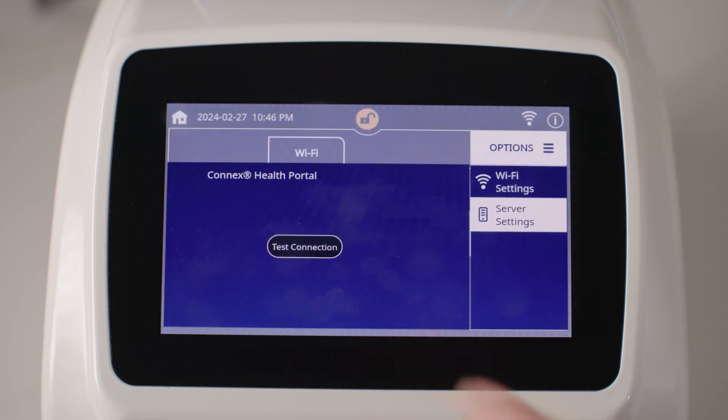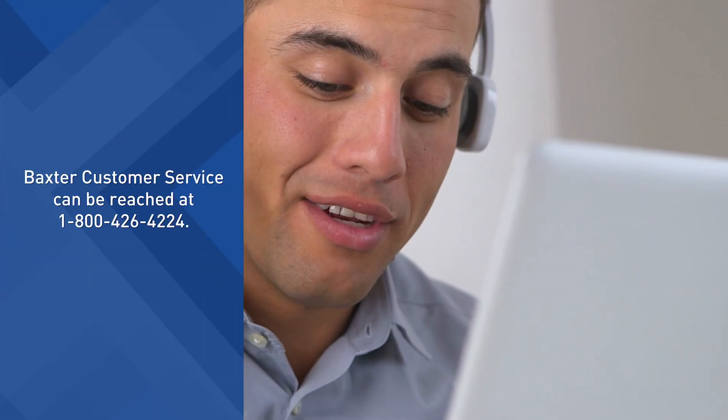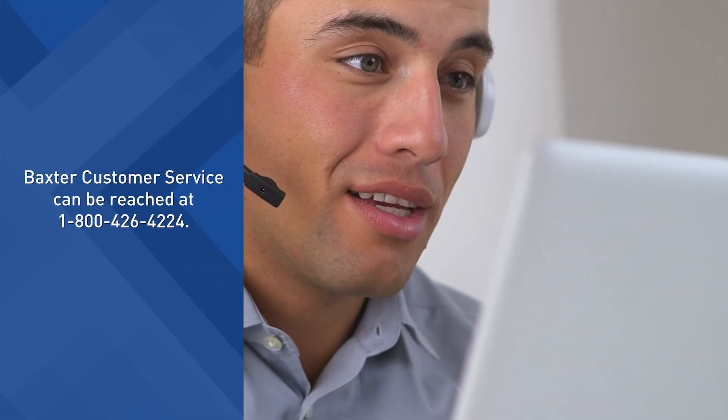Tap OK to exit. If the connection is unsuccessful, check the Wi-Fi network settings and try again. If the problem persists, contact Baxter Customer Service.